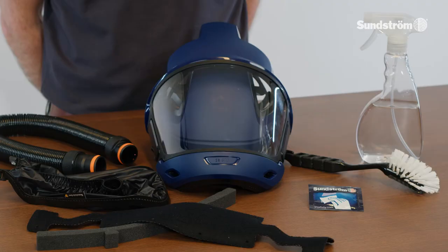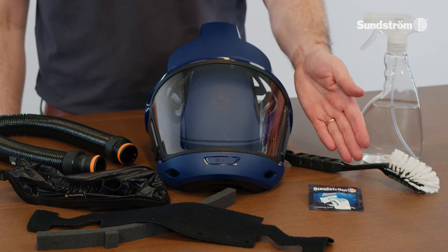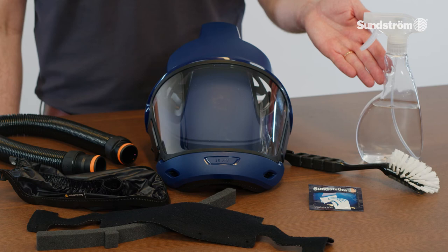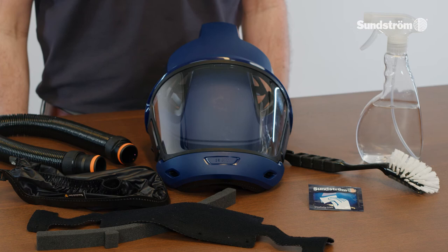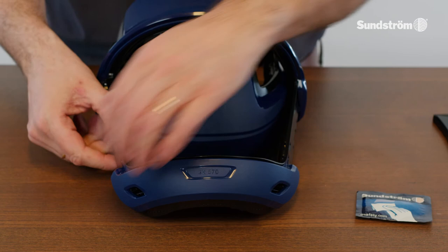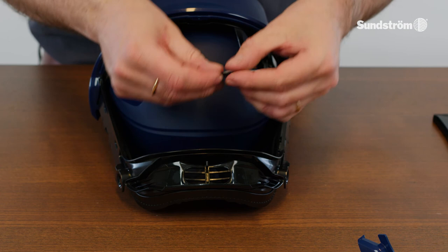If necessary, spray the face shield with 70% ethanol or isopropanol solution for disinfection. If the equipment is more heavily fouled, the head harness seal, face seal, and sweatband can be put in a laundry bag and machine washed at a maximum of 40 degrees Celsius. Other items can be washed in the dishwasher at a maximum of 55 degrees Celsius. Clean the exhalation membrane and the valve seat.